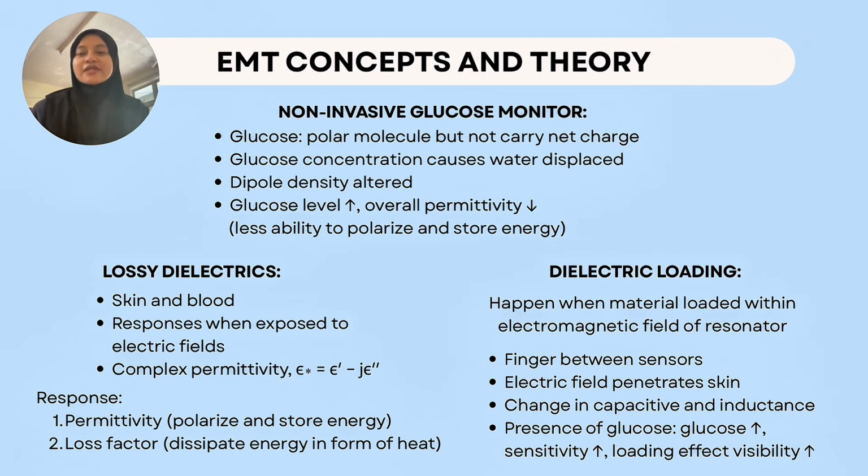Next, moving to the dielectric loading. It happens when the material is loaded within the electromagnetic field of the resonator. When we use the device, the finger is placed between the sensors. The electric field is able to penetrate into the blood from the skin. When this happens, there are changes in capacitance and also inductance. To be clear, the higher the glucose, the more the sensitivity increases, which causes the loading effect to become more visible.